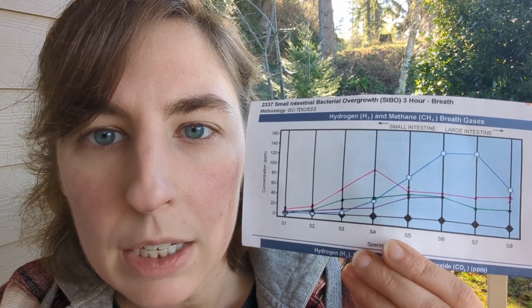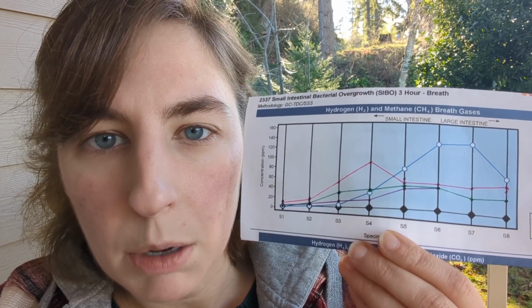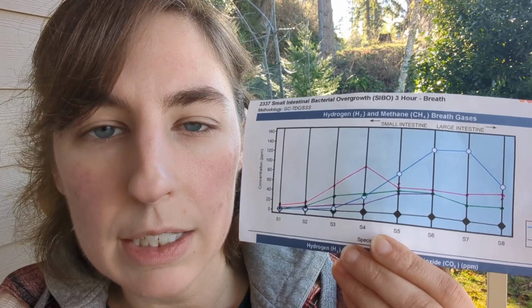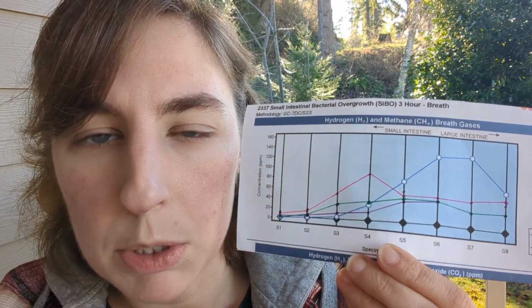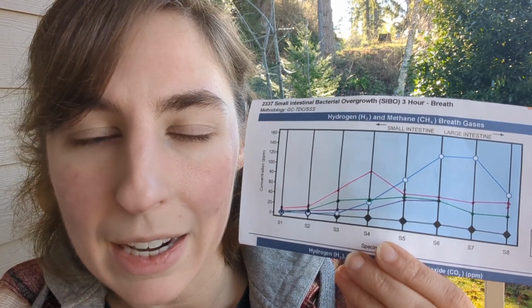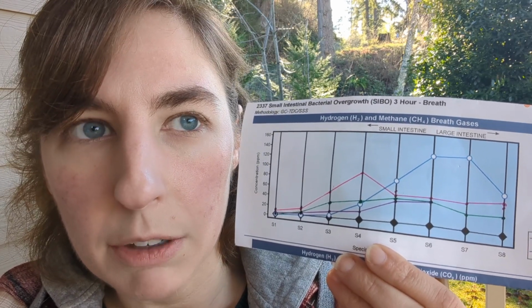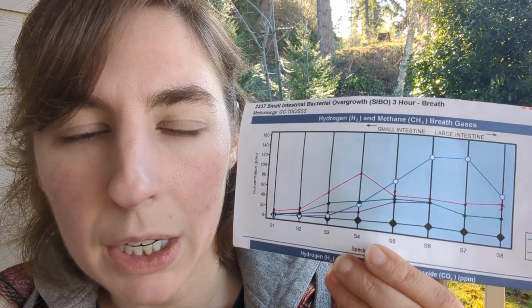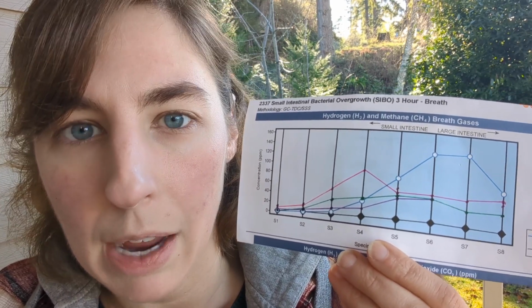The pink line is the second lab test that I did. And I did a whole video on the comparison between the lab test and the Air 2 device that I did at the same time, and the reasons for why there's the discrepancy between them. The Air 2 doesn't go as high as the lab goes, so it's just a little bit different. So I'm just comparing the test I took this morning to the other Air 2 test, because that's like comparing apples to apples.